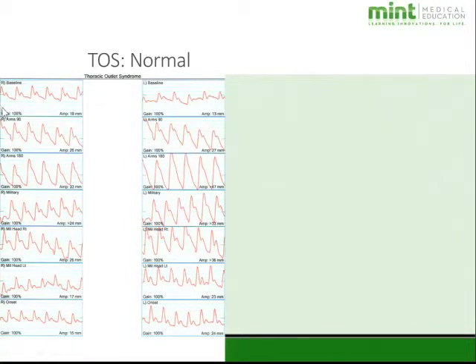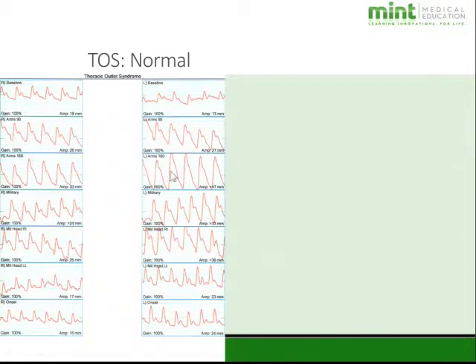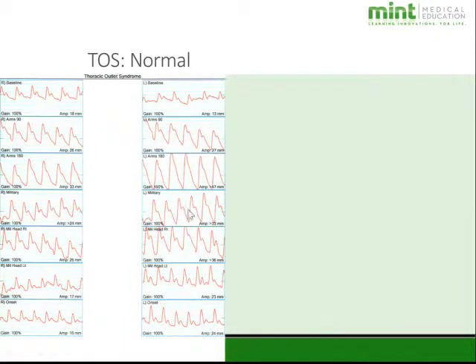Here is a normal thoracic outlet case. At baseline, we see sharp upstroke and dicrotic notch on both sides. With arms raised to 90 degrees, no real change. At 180 degrees overhead, the notch decreases slightly but is still present, and amplitude actually increases — likely a gravity effect seen in most normal patients. Moving through military position, no significant change in waveforms on either side.